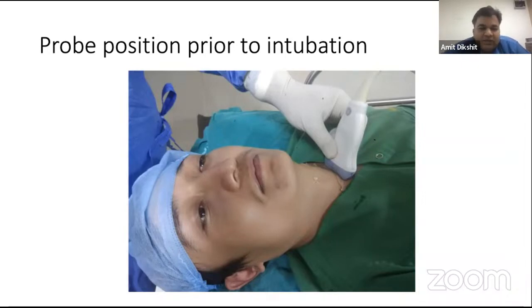So when both are seen in one view, it gives me peace of mind, because most of the time when my PGs and fellows are intubating, I really want to know where the tube has gone. Most of the time, the junior most PG will almost go into meditation and say nothing. We are so worried about what is happening, where is the tube, and they will not tell anything. So it really increases the anxiety.